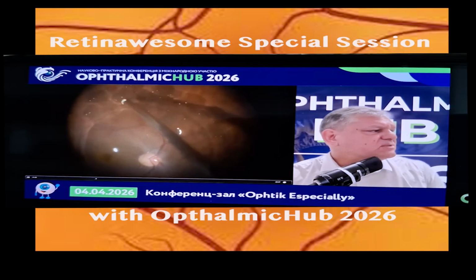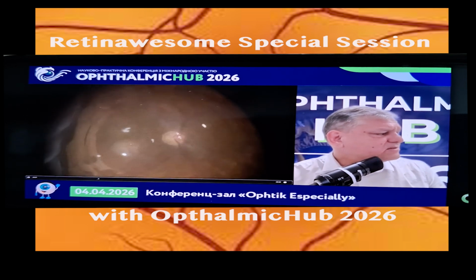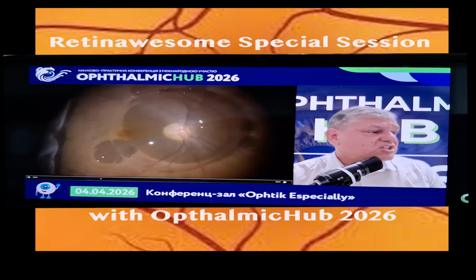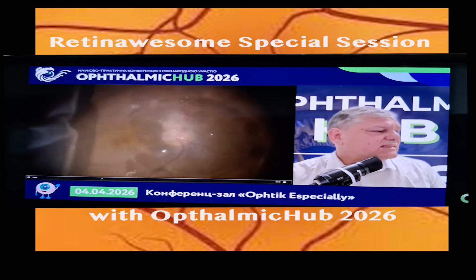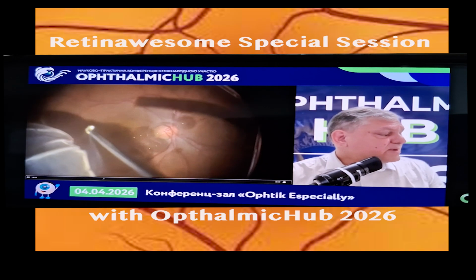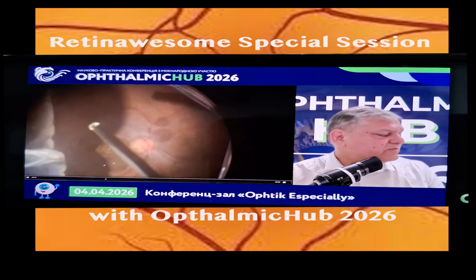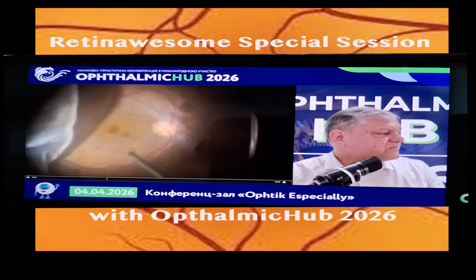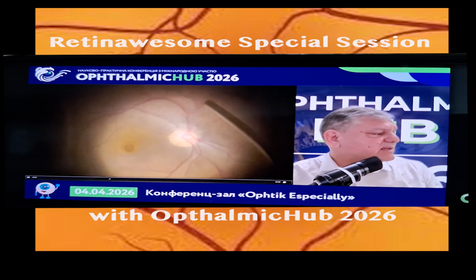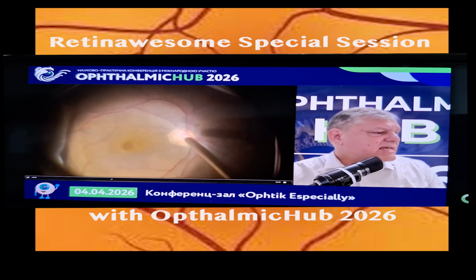So why am I doing that now? I'm removing the perfluorocarbon liquid, and I see the peripheral retinal detachment there. The next step of the procedure is to go after the very retinal periphery and remove the adhered hyaloid that is there. As you see here, the hyaloid causes some traction at the retina. So by removing the hyaloid further, it's better that you don't get any tractions.